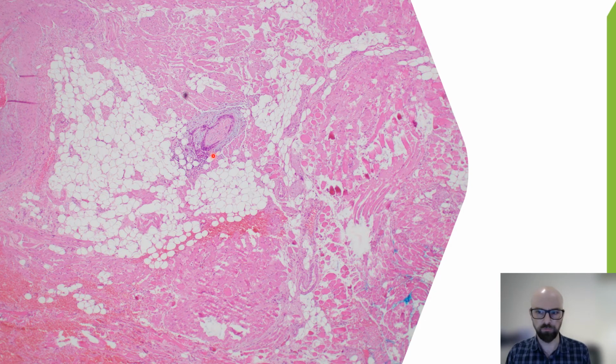And extratumoral foci of PNI, which we see here, where it's a nerve which is well beyond the main tumour focus, quite important to pick up because it has even worse prognosis.